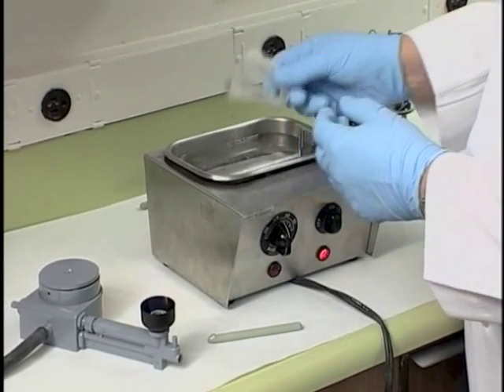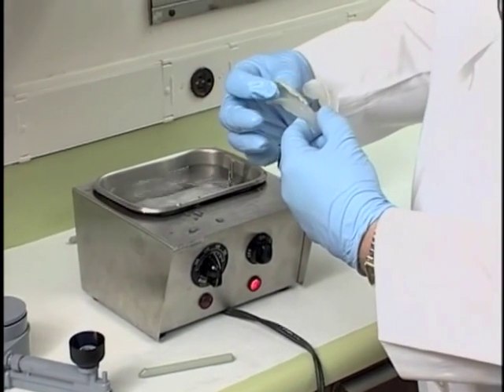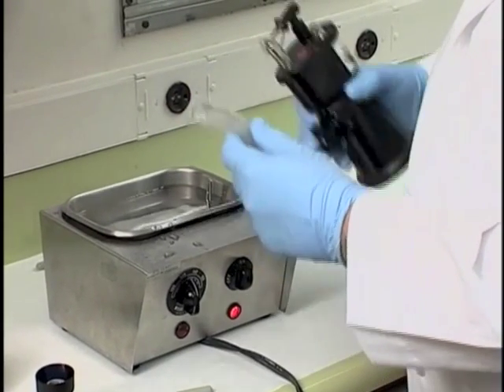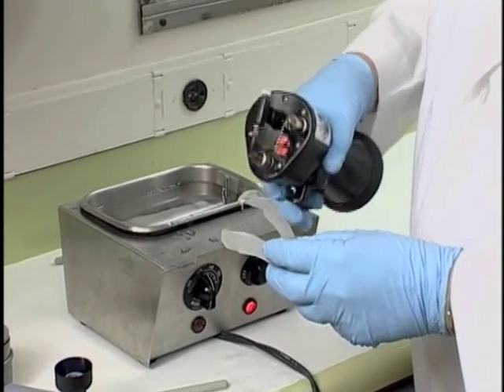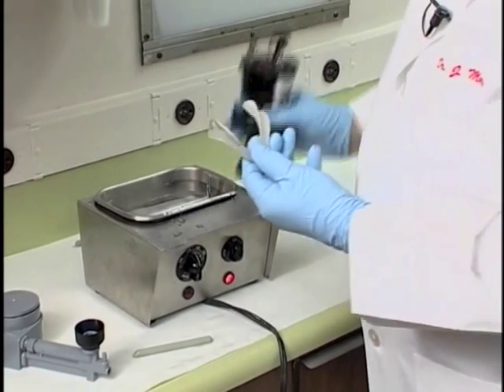Once we've got the material on there, we wet it in wet fingers, and with the wet fingers build it up like so. Then we take our torch and we superheat the material so that it's nice and moldable.